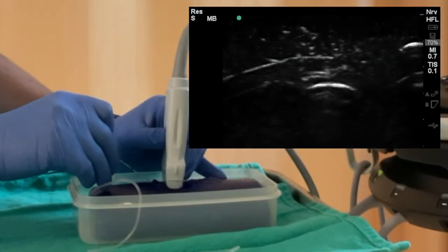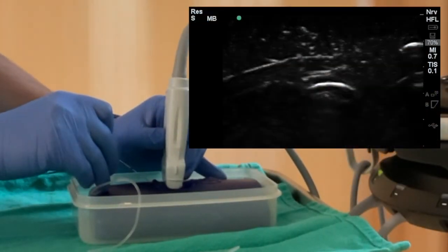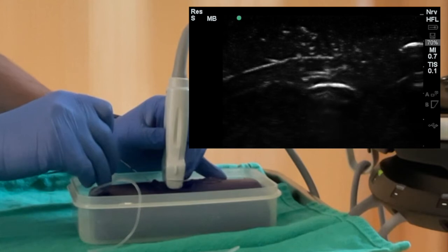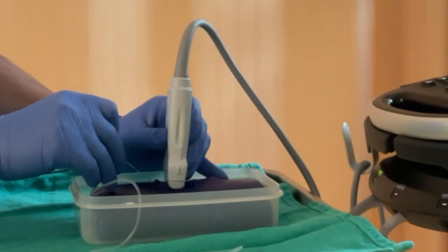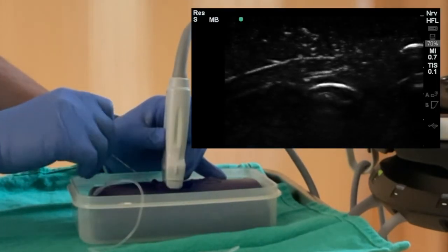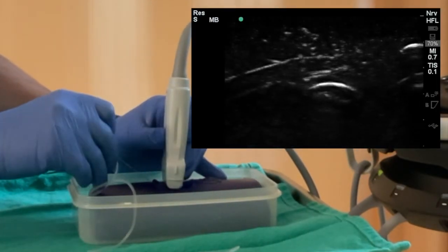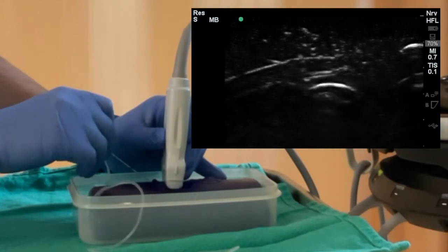Observe the rapid in and out movement in this image, and now side to side wiggle movements in this out-of-plane needling.